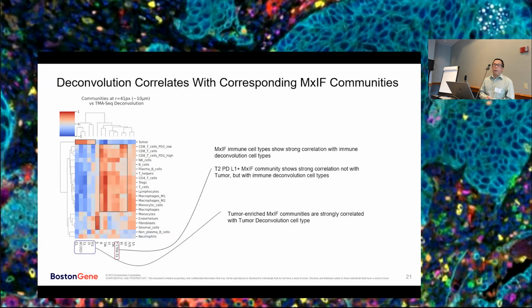After the validation of this imaging experiment, we actually took out each individual core, extracted the RNA, and performed RNA sequencing. The purpose is to find the correlation between data from these 2 probings.